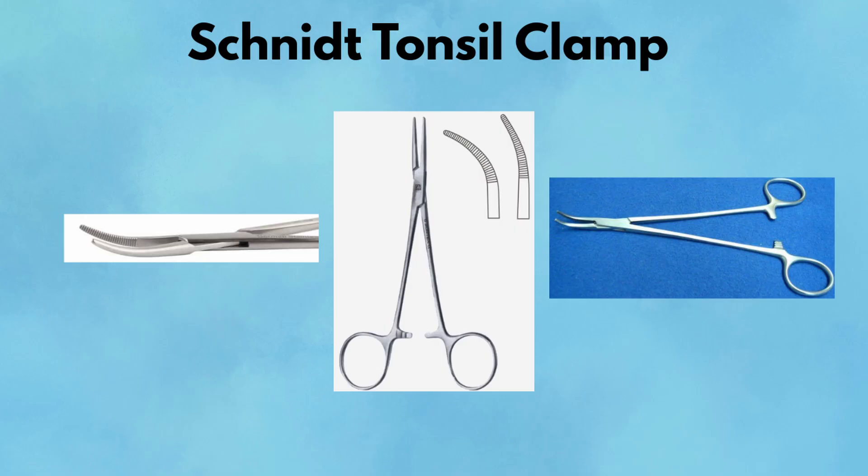Tonsil Clamp. The tonsil clamp, or schnitt clamp, is a long, curved, fine-tipped instrument designed for deep dissection and vessel isolation. It has delicate, slightly tapered jaws with longitudinal serrations, making it ideal for passing ties or dissecting around tubular structures. Despite the name, it's not just for ENT — you'll see it in vascular, endocrine, and general cases alike. In thyroidectomies, it's used to dissect around the trachea or isolate vessels. In vascular surgery, it helps pass ligatures under arteries. Its long reach and narrow profile let it navigate confined spaces with ease.